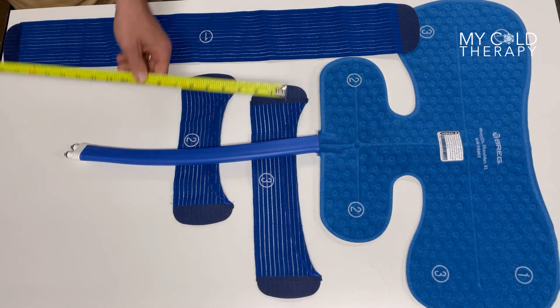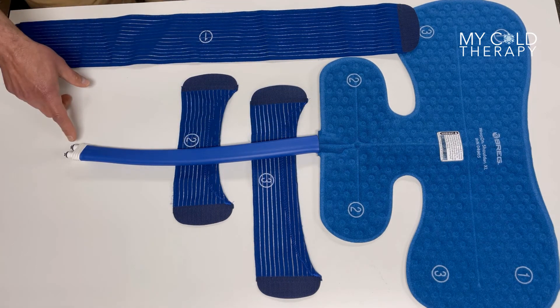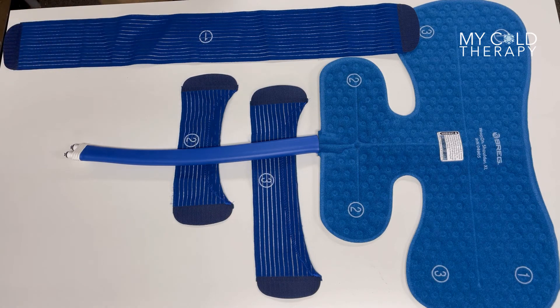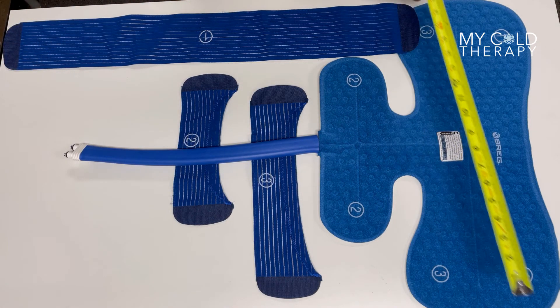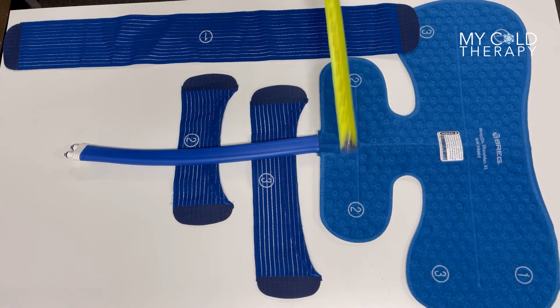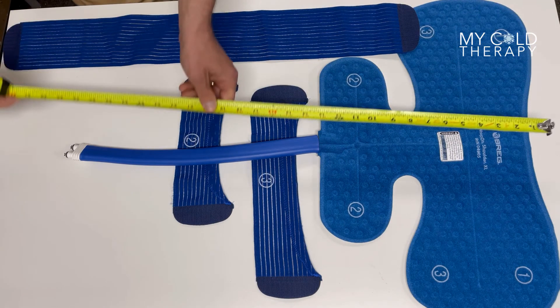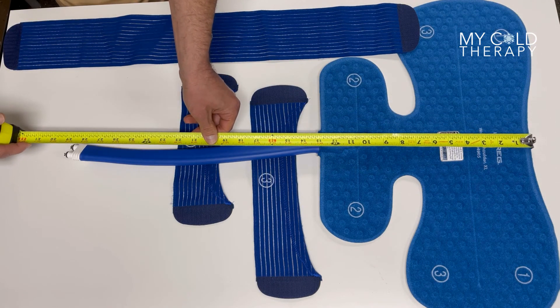The hose on this particular pad is 16 inches long, and notice this has two male connectors. Every Breg pad has different connectors, so the Cube has two males. The width of the pad is 21.75 inches at the top and 12.5 inches at the bottom. The pad itself is 13 inches high.